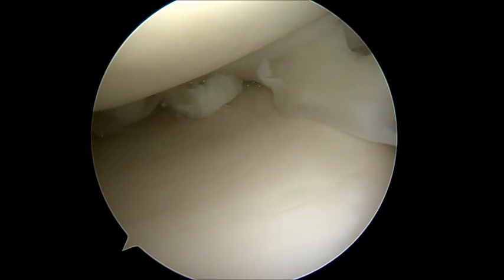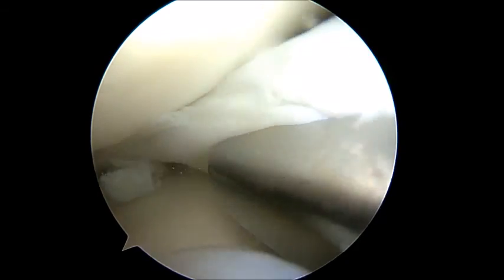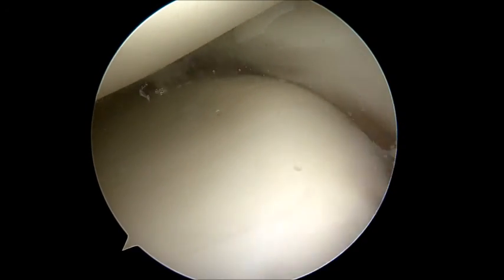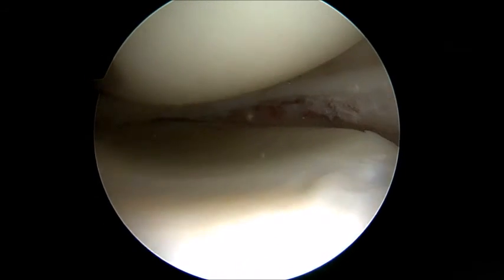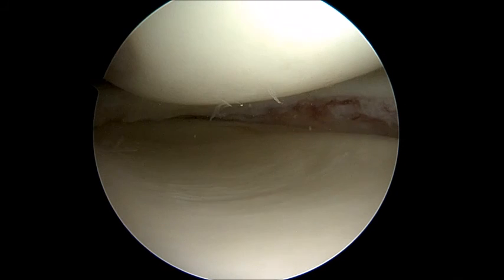Next, a grasping device is used to remove the entire bucket-handle meniscal tear fragment. After the displaced bucket-handle fragment has been removed and the loose debris is cleaned up, the remainder of the meniscus is stable to probing with no residual loose unstable flaps of tissue.